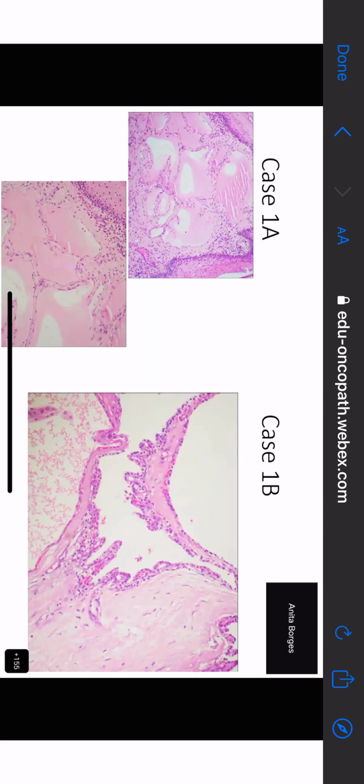So tell me, you said something very interesting. And that was also something that Dia said, that this is a discontinuous lining. And you said that you found it continuous and therefore it is an epithelium. Dia said it was discontinuous and that's why she thought it was an endothelium. Am I right, Dia? That's what you said, right? Yes, ma'am. But I was telling that it is a lymphatic endothelium, not a vascular space endothelium.